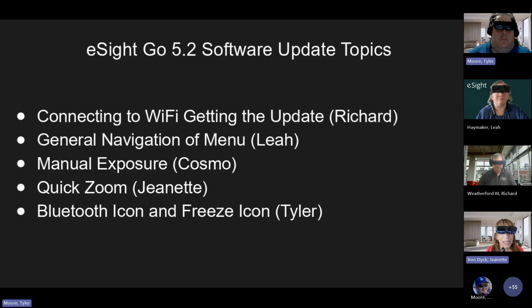So just to tell you that Spot Zoom, or what some people know also as Finder on this button, works when you are zoomed up. So you have to have some level of zoom in order to use Spot Zoom or Finder. So for example, let's just say you're zoomed up 10 times because you're doing some fairly close-up work, and you like that level of zoom.